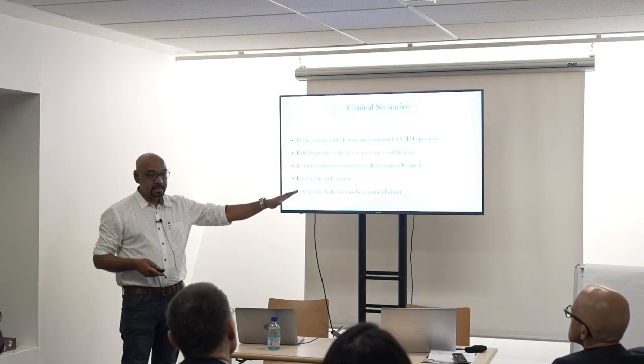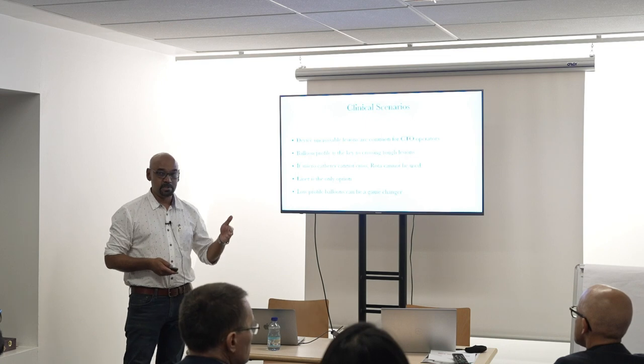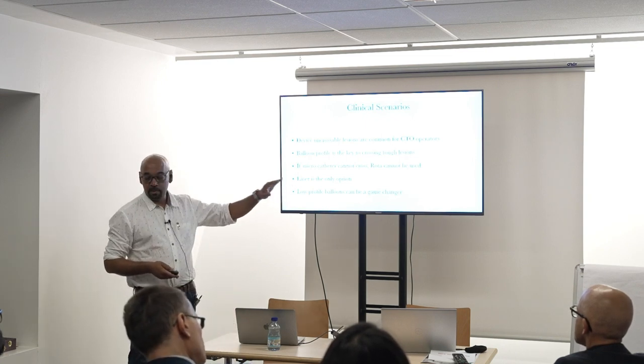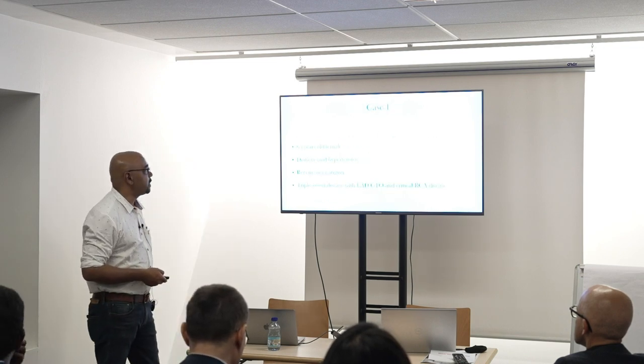And laser, as of today, is the only option available. And a lot of places don't have them. And the cost is also quite prohibitive at this point. And that's where the low profile balloon is a game changer. And it has to be available in the market for every complex operator.